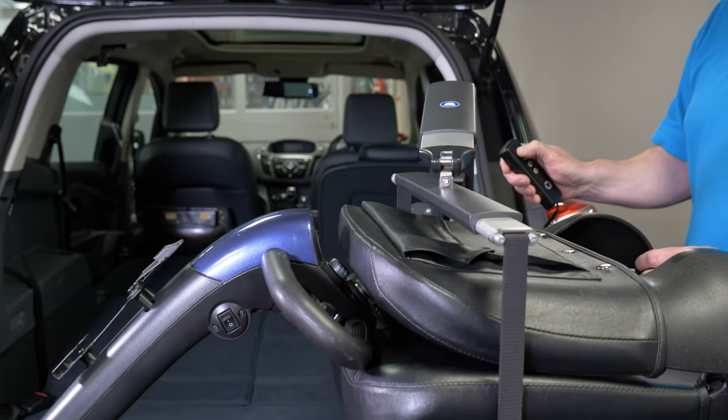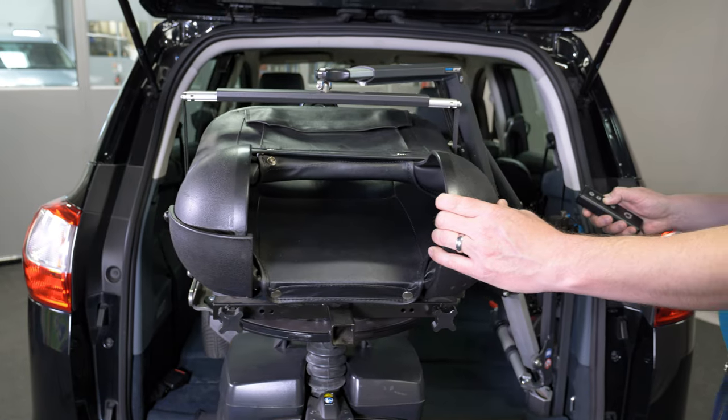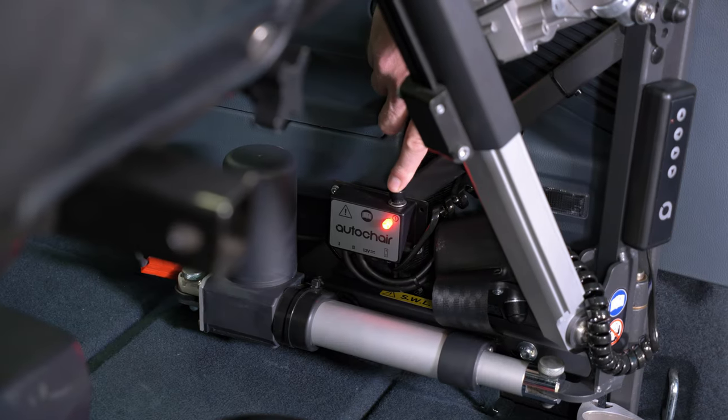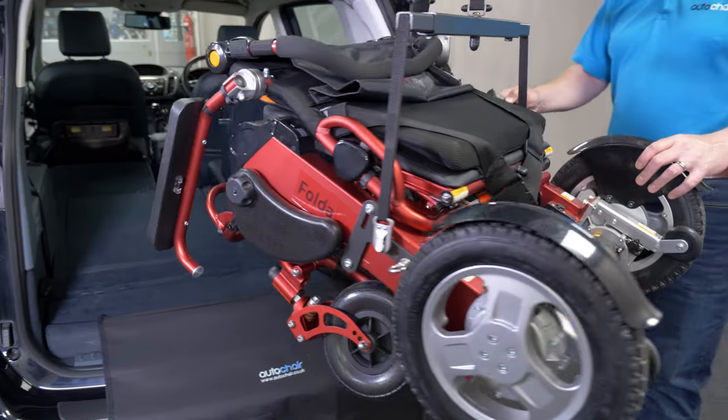A boot hoist lets you retain your independence when venturing out and about. We have one of the largest ranges available, which means the combination of car and scooter or wheelchair are almost endless, so there's no need to compromise on the vehicle or device that you really want.